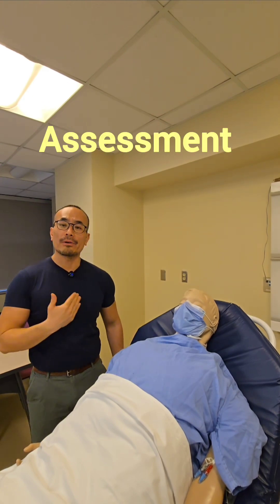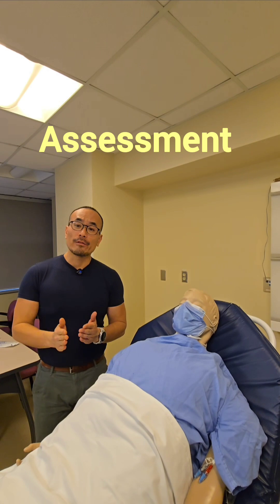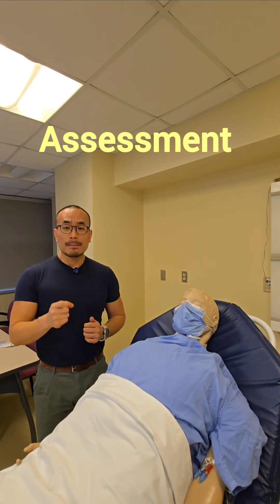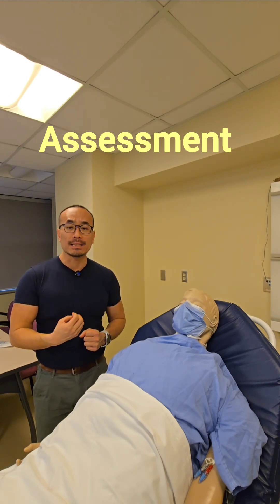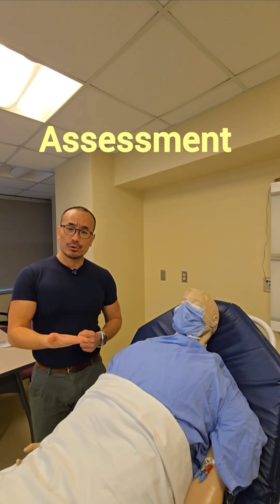Next we're going to assess the patient's portacath size by inspection and palpation. Before that, we're going to do a few housekeeping items — we want to make sure that we perform hand hygiene, and we'll also make sure the patient is the correct patient by using at least two positive patient identifiers, including checking their ID band and explaining the procedure to the patient.